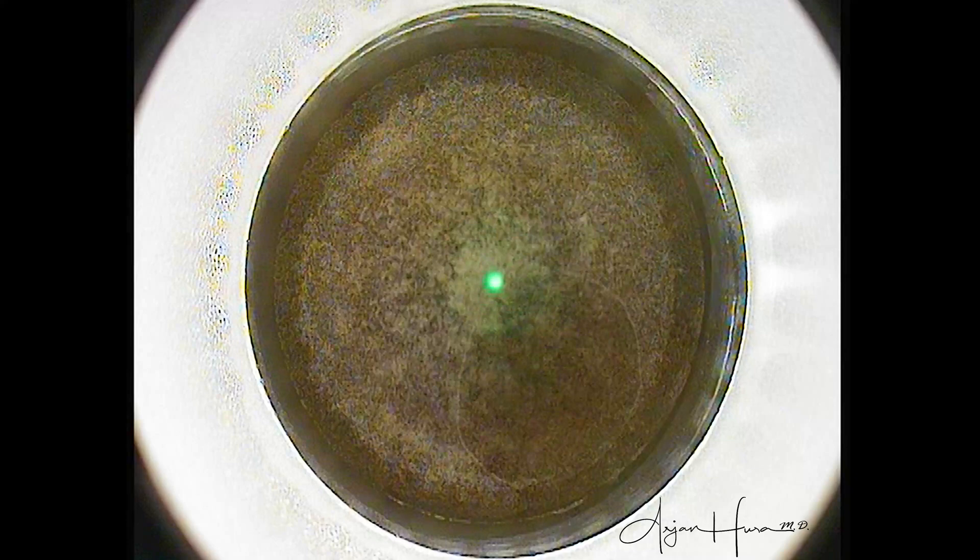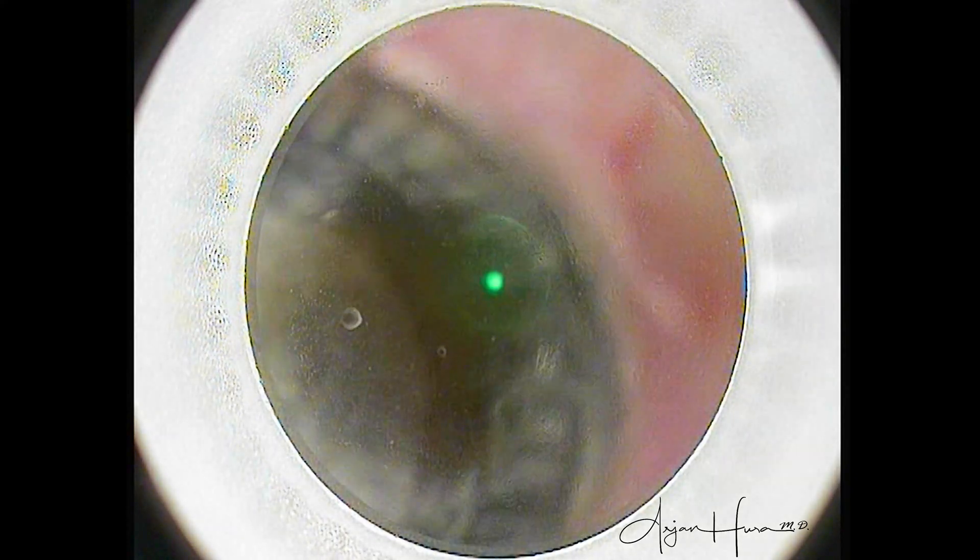The appearance of that air bubble tells me that the laser settings are pretty optimized, and that this is probably going to be an easy lenticule to dissect and extract. The actual lenticule creation just took 24 seconds, and now we move over to the other eye.